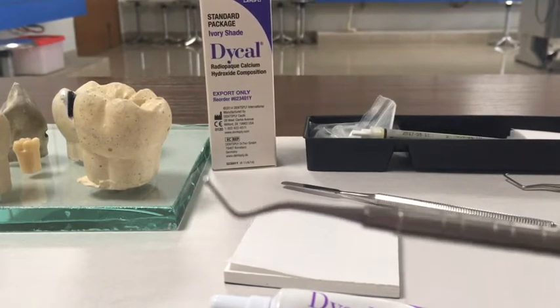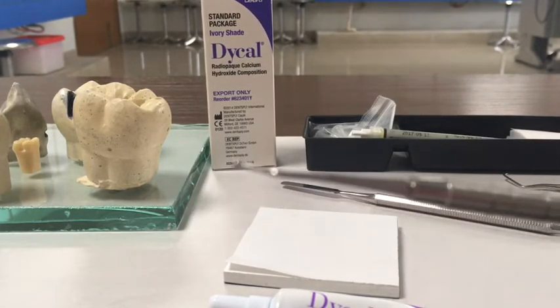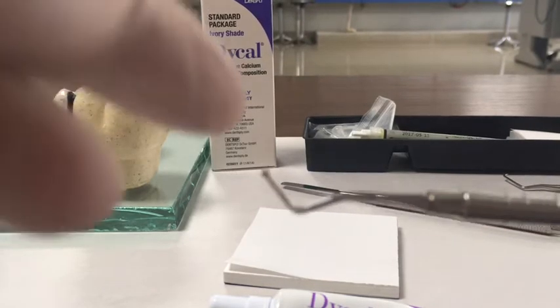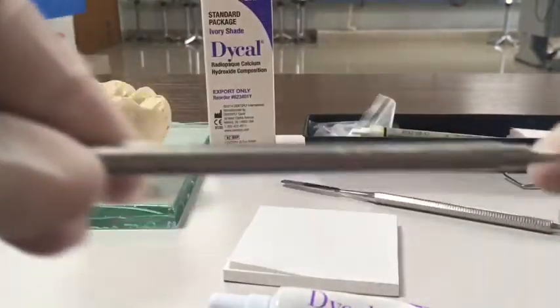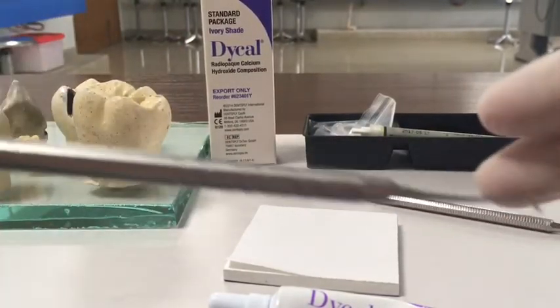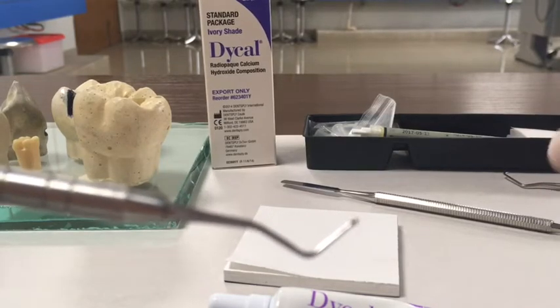Next we have a Dycal applicator. A Dycal applicator has a small ball end on either side, and this is ideal for placement of calcium hydroxide cement inside the cavity preparation. You can also use this for mixing the base and catalyst together.